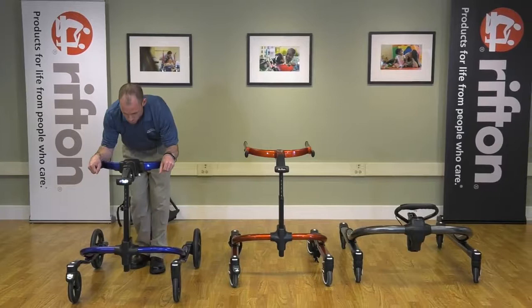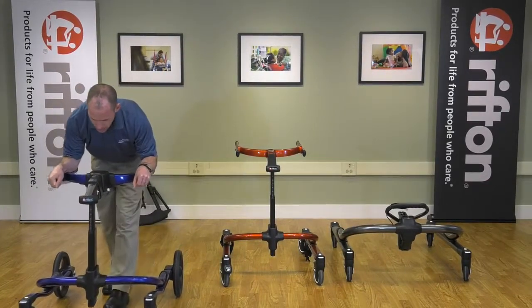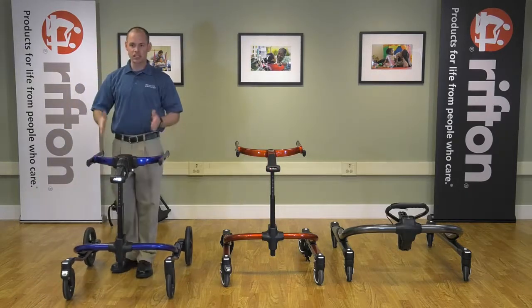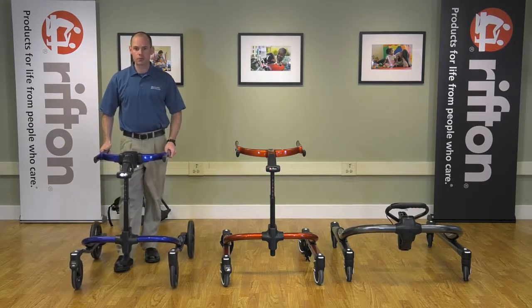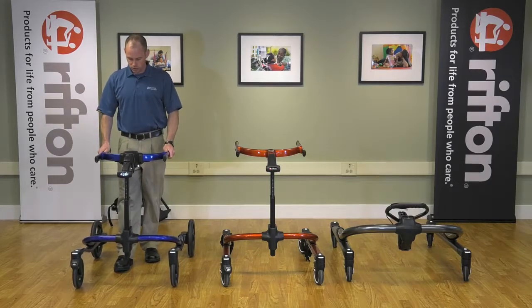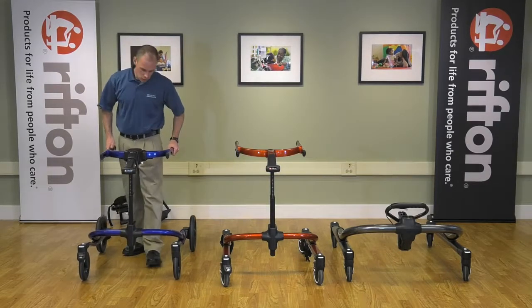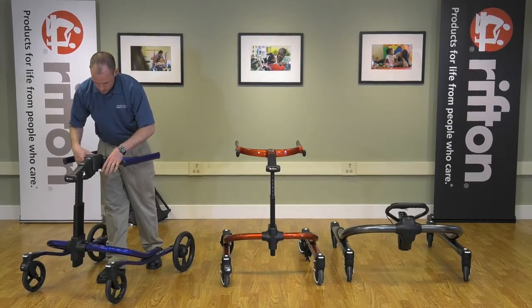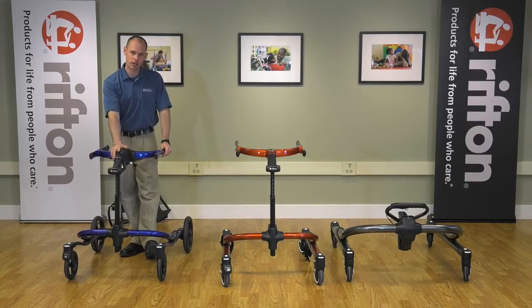Obviously, a client will have more weight on the pacer, and as they walk, the pacer shifts back and forth and up and down so that they're not limited to a rigid gait training structure, and that allows them to acquire a more typical gait training pattern. So that's the basics of your dynamic feature. Of course, if you do want to lock it back out again, lock out the vertical movement, lock out the horizontal movement, and you've essentially got a standard upper frame.